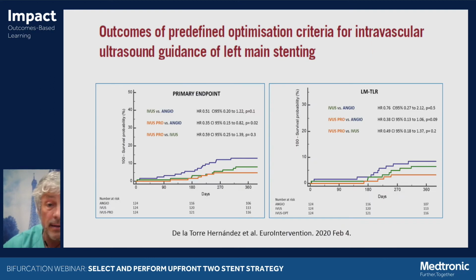This is really criteria that works because you can see here that our protocol was associated with better outcomes compared to angiography or just a group of IVUS without any protocolized usage.